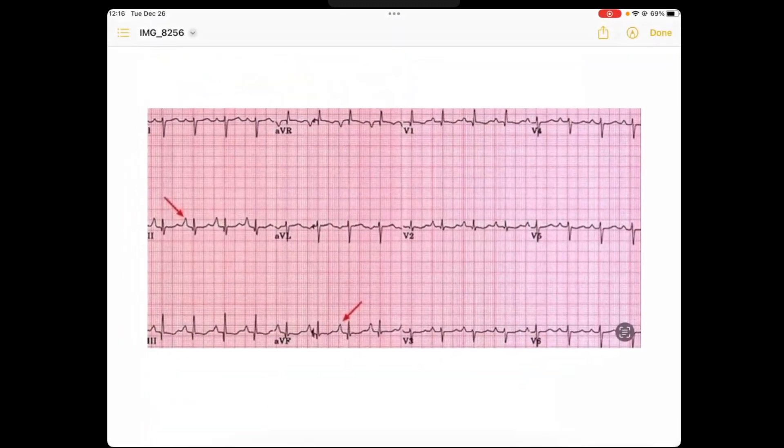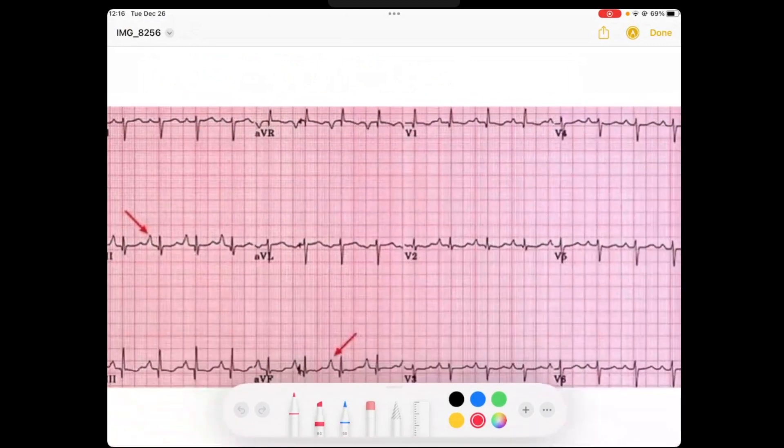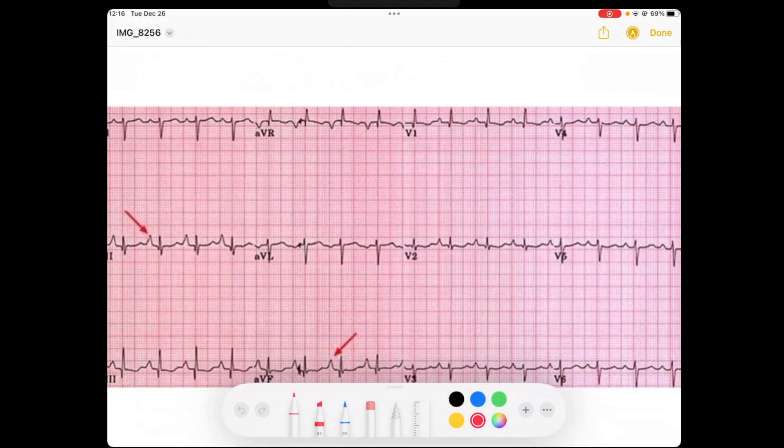So here we've got our EKG. And remember, we're looking for atrial enlargement. So we're going to look at the P's. What could be some causes for right atrial enlargement? We would think maybe right ventricular hypertrophy from lung disease. So sometimes when you see if you know that maybe you see some evidence of right ventricular hypertrophy, then maybe they've got right atrial enlargement.